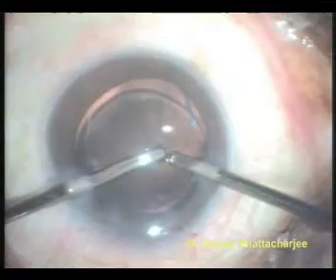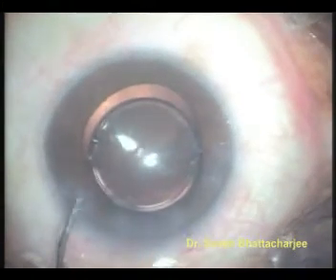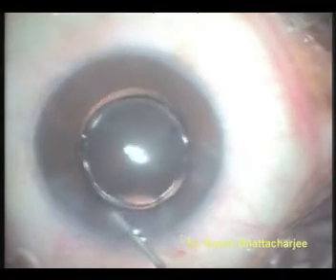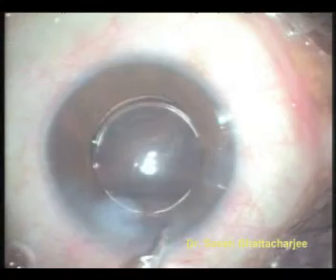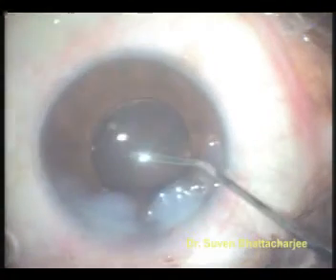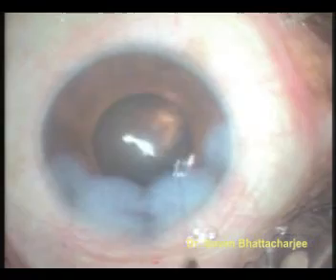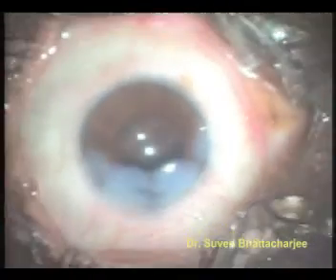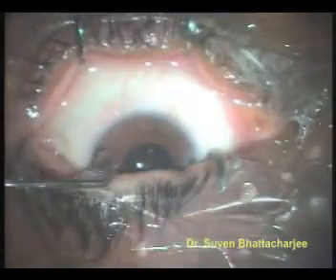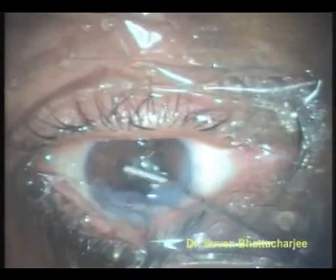It is important to remove all of the viscoelastic material used. Thereafter, a miotic agent is injected into the anterior chamber to constrict the pupil. The wound is hydrated with balanced salt solution to ensure that the lips are well opposed. Some more balanced salt solution is injected into the anterior chamber and final centration is performed. All the wounds are hydrated including the side ports. The wound is tested for any possible leakage. The speculum which was holding the lids apart is now removed. The patient is asked to squeeze the lids and the tension and leakage is tested once again.